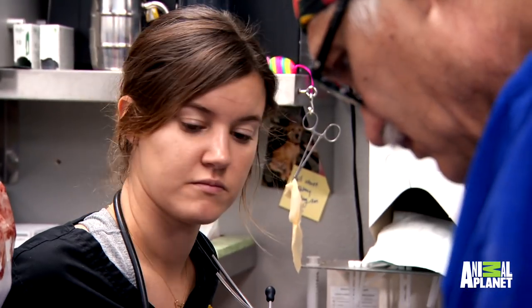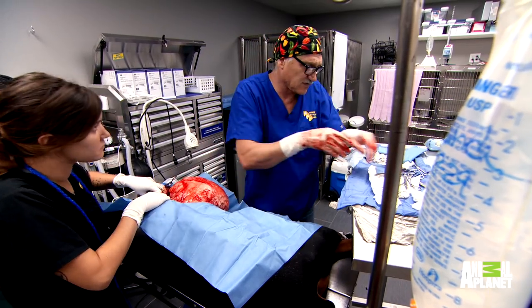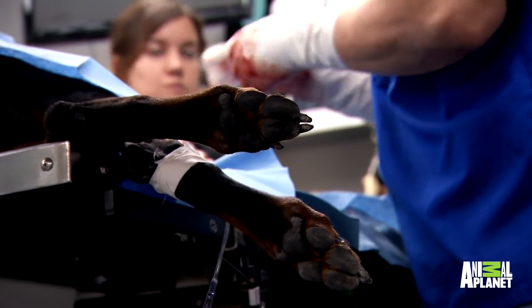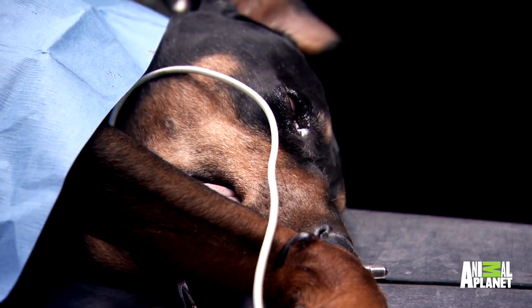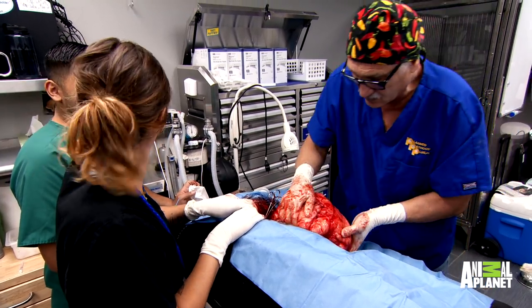Let's see what I got. There's a few good sized bleeders hooked to this. I think I got that main bleeder. Pretty good. It's kind of stuck together. It's a good capsule.